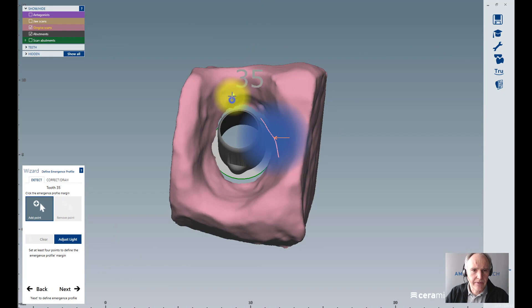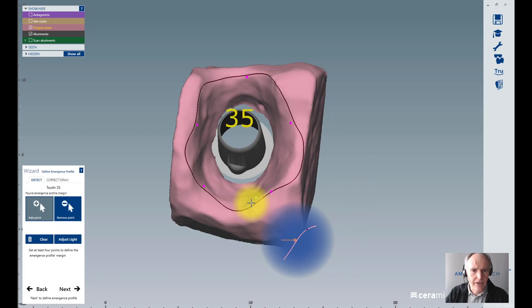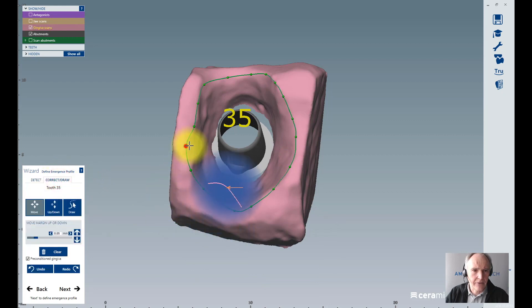Next step, I create the upper line for my emergence profile. I need at least four clicks - when you have five it's also okay. If you want to correct, you go to correct and draw and you can drag and drop these points to the right position you want to have. Then you click on next.